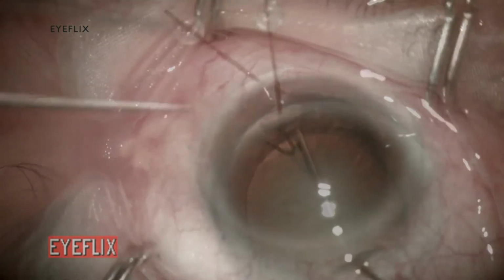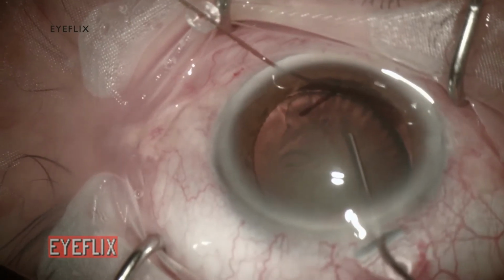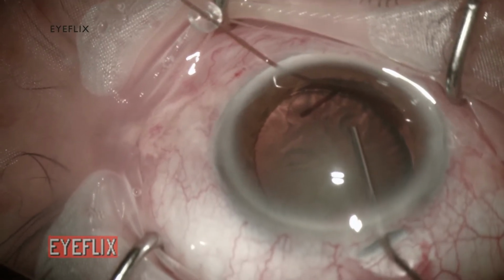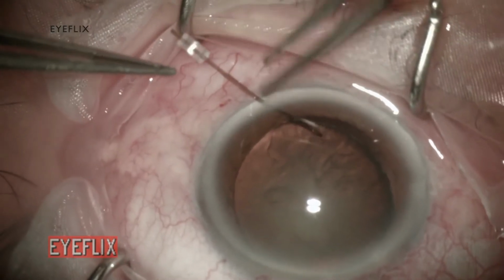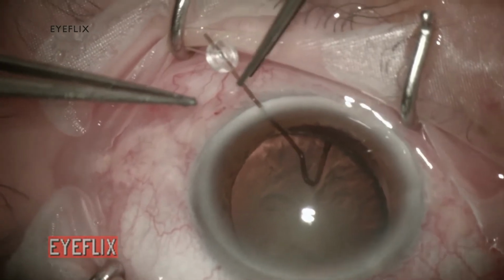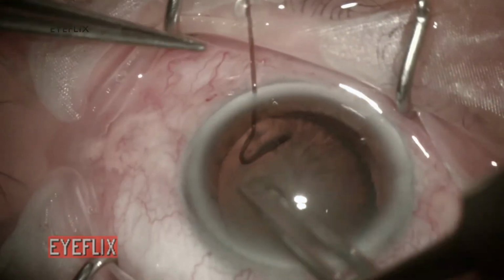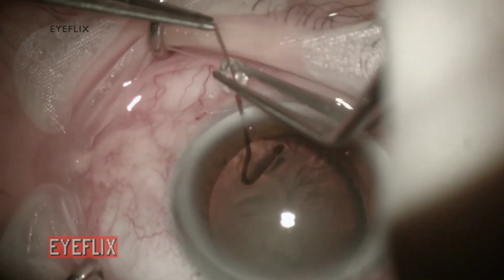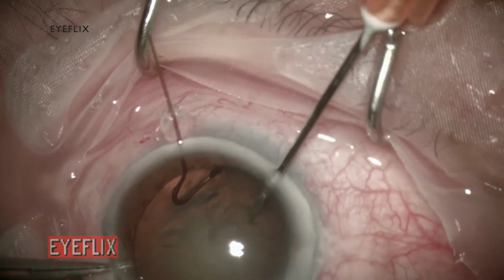Once I have completed about 90 degrees of the capsulorhexis, I insert the first capsular retractor in order to get more support and centration of the bag. I use small limbal incisions to insert the hooks, trying to keep them quite vertical and short. I find this helps me maneuver the hooks more easily inside the eye. If the tunnel is too horizontal and long, it will be much more difficult to move and tilt the hooks in the proper position.